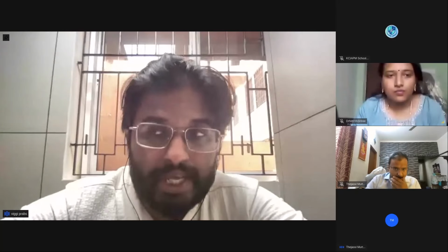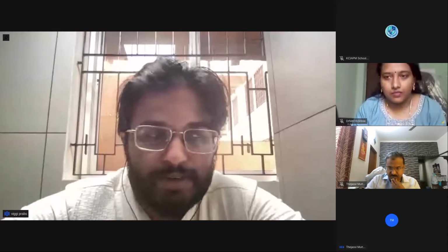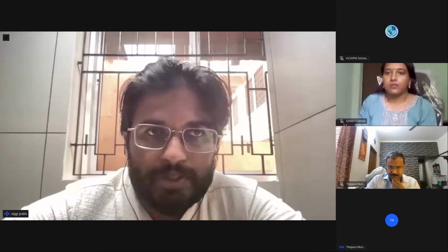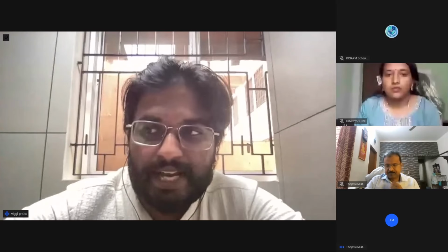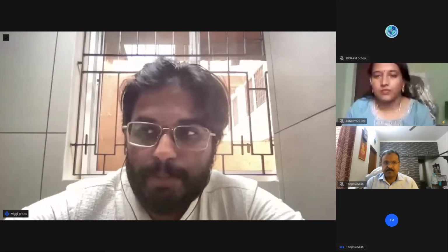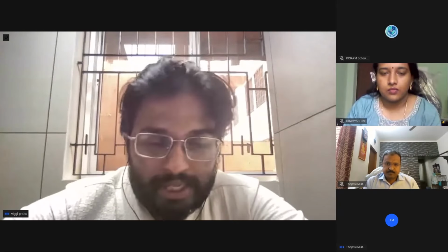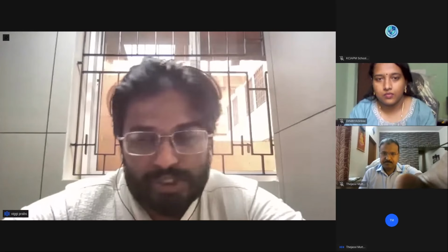Today's topic is truly an exciting one: a pattern-based diagnostic approach to inflammatory dermatosis, an algorithmic approach. Dermatopathology, as we all know, often presents as a diagnostic puzzle. This session will help us understand how a structured, step-by-step approach can make the process clear and logical.